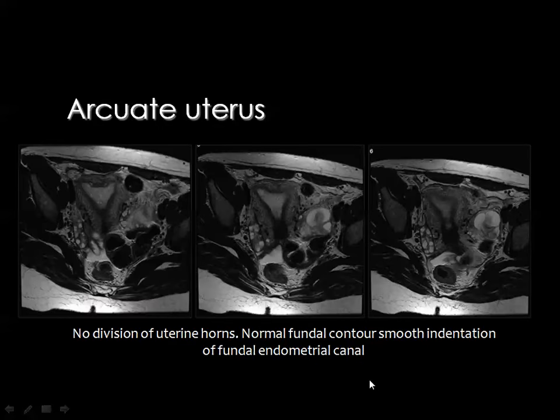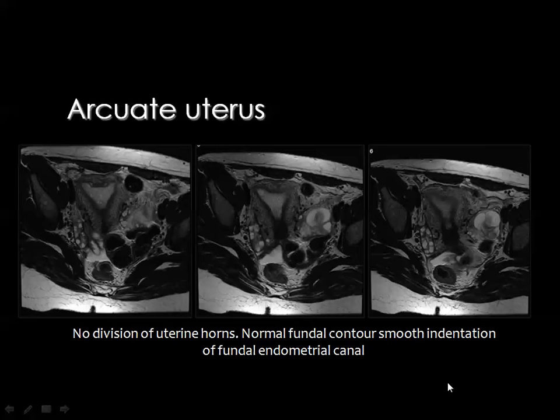This is arcuate uterus with a fundal depression; the endometrial cavity is not divided, and the junctional zone and ovaries can be appreciated on MRI.